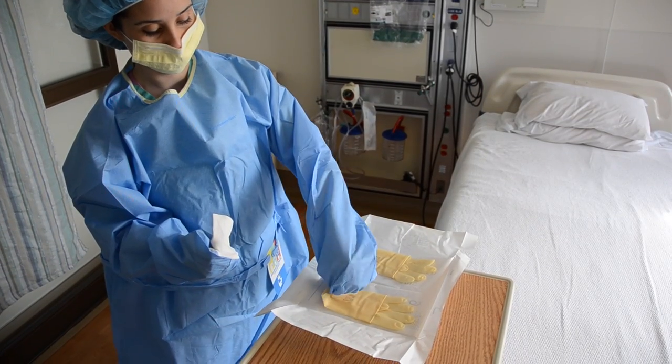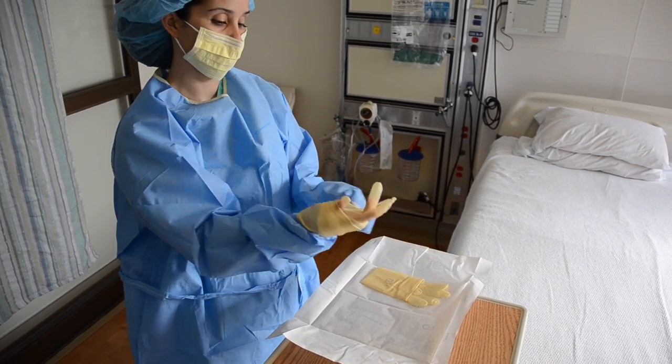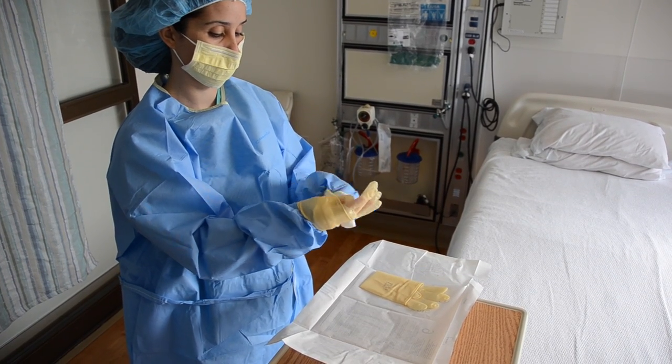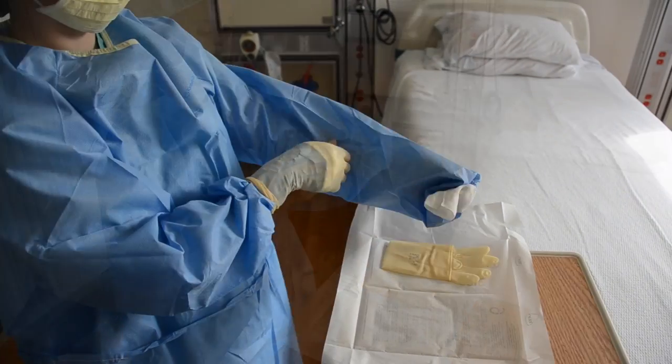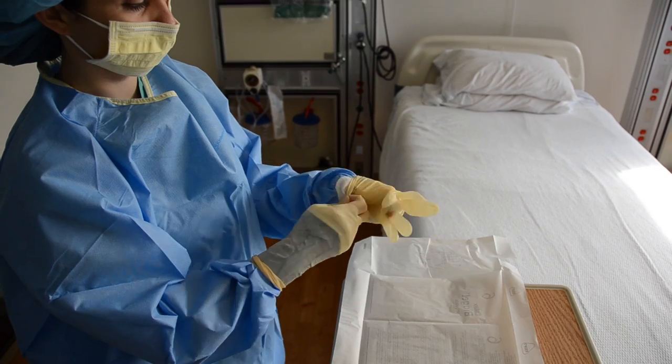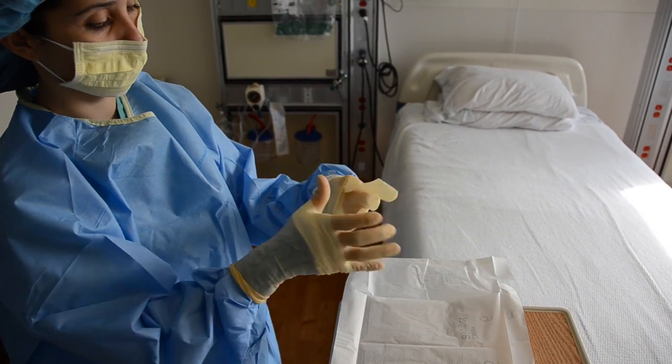The physician keeps both hands covered by the fabric as the right glove is applied. The left glove is then applied, again making sure that the fingers stay covered by the fabric until the sterile glove is in place.